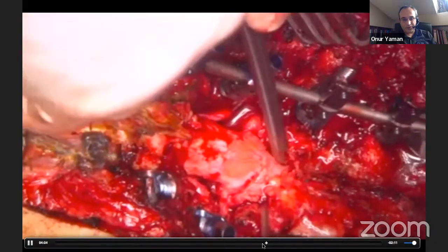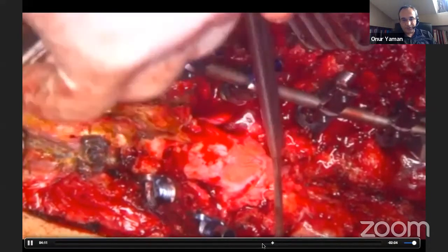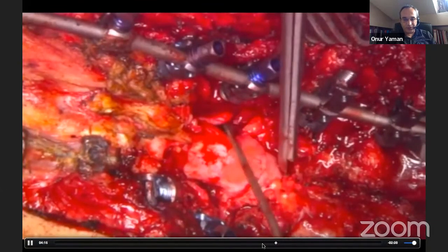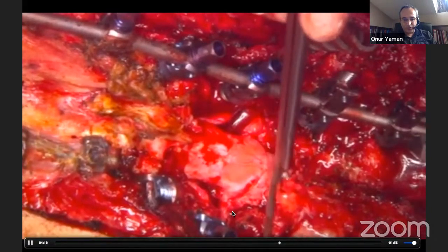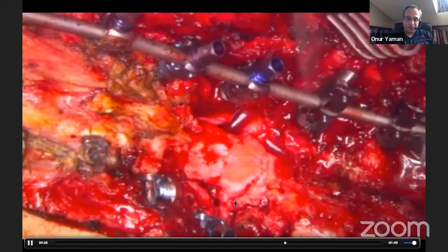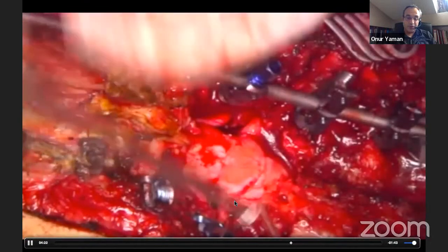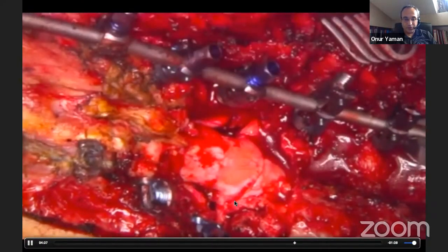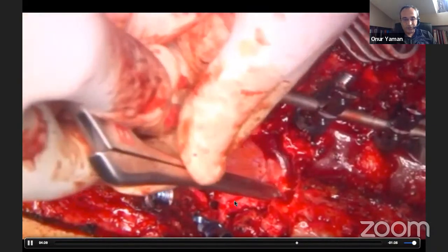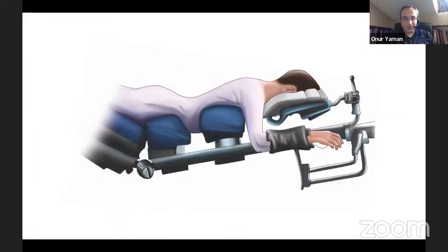At the end of surgery, when you're closing both sides, this nerve root comes out only in one foramen — we call it a giant foramen. Try to close the pedicle osteotomy sites — the bones together. But the most important thing is to keep neuromonitoring. What we are doing during surgery is not compressing the screws because most adult degenerative scoliosis cases have osteoporosis — just use the table. The only thing you have to do is deflex the table.